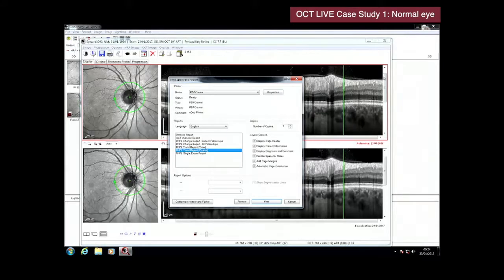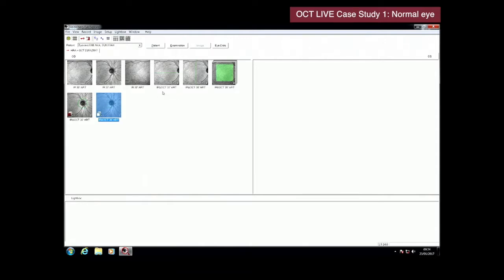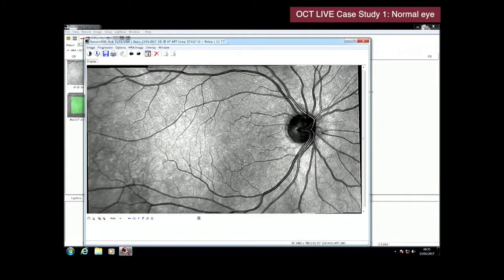Okay, let's go back to the actual conventional scans. If we look at the 3 fundus images to start with, we can select the 3 fundus images and very quickly create a wide field image. Okay, so this gives us a field of view that's approximately 30 by about 50 degrees. And these images can be extracted from the conventional OCT scans in the same process. Again, optic nerve head, retinal vasculature, you can see the arterioles, venules, and small order bifurcation of blood vessels.